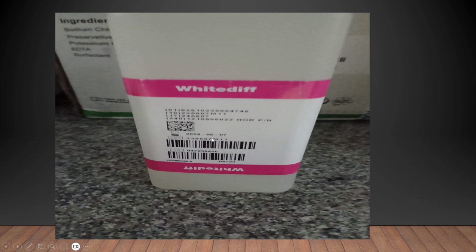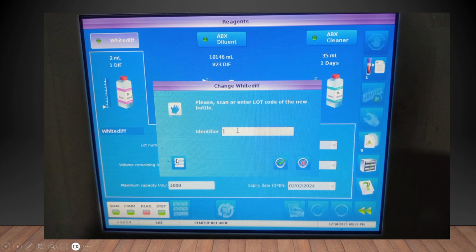One important thing you need to remember is this: always from the right side, if you take the first digit, and then this third digit is always an alphabet. Many times there will be an I, so many people will think that this is 1. No, it is not 1. The third one is always the alphabet. If you have to manually enter, you have to click on this button, the whole keyboard comes, and then you manually enter here.